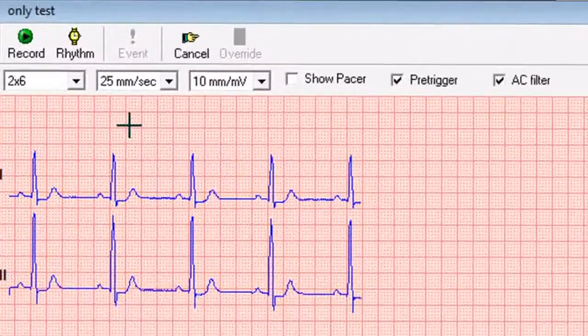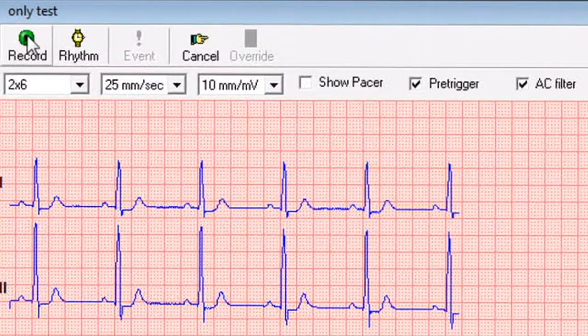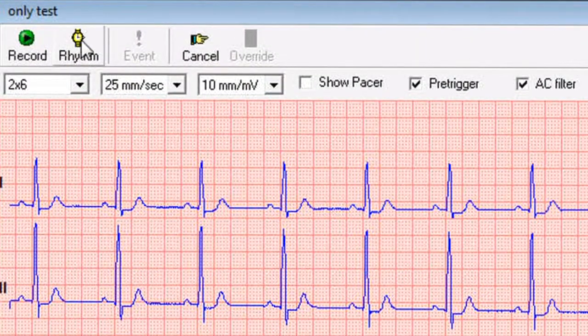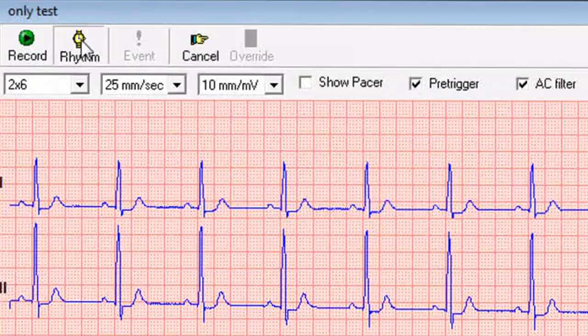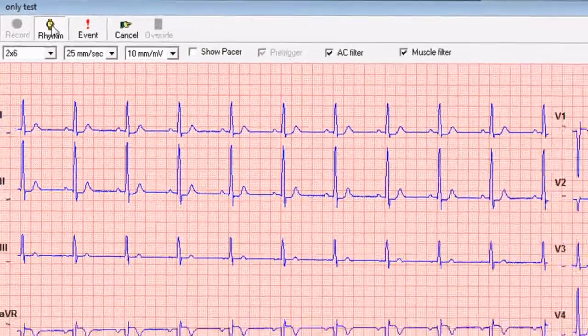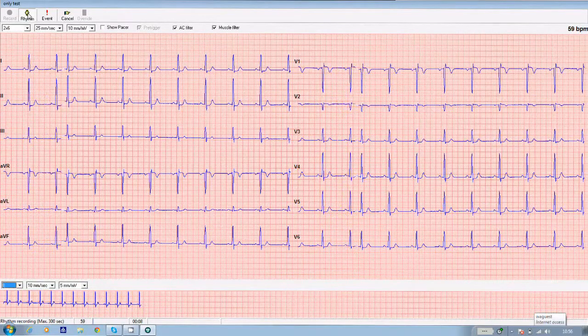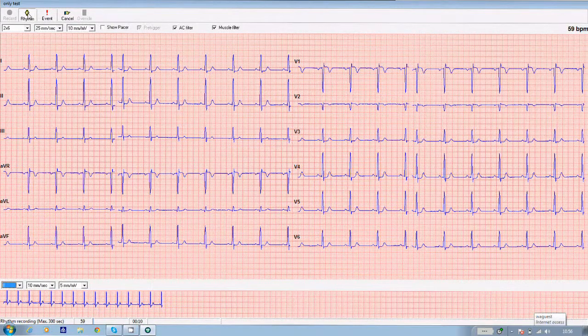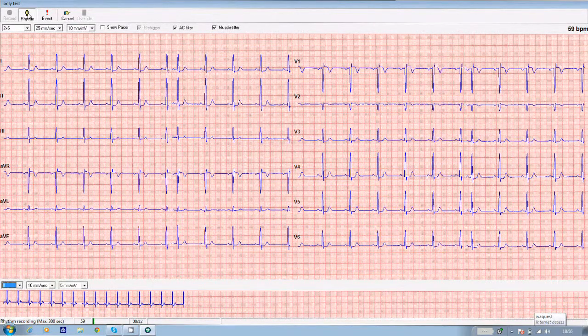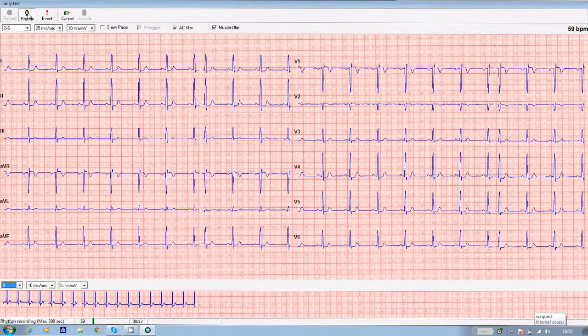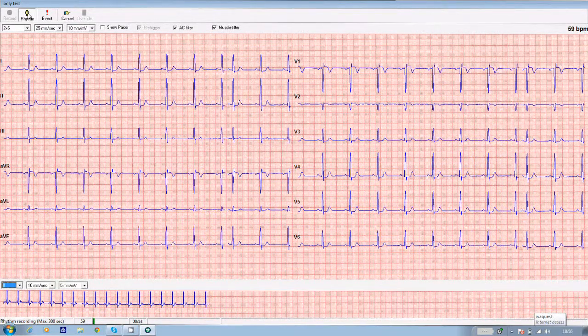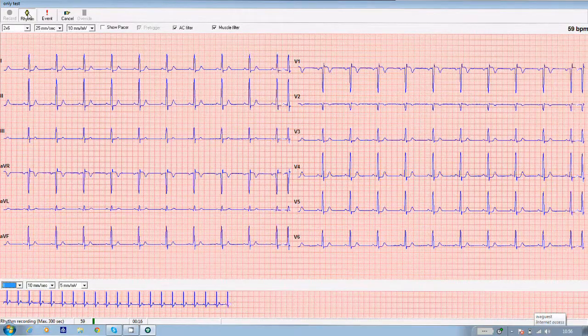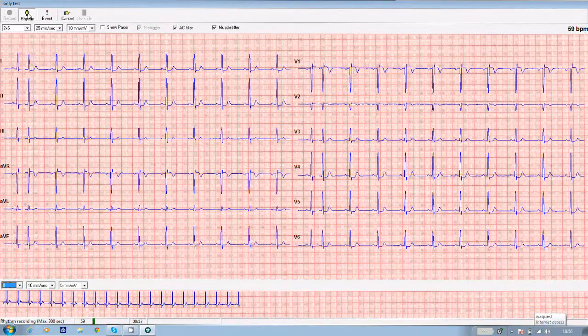But to take a rhythm ECG, instead of clicking on record in the top left hand corner, click on the rhythm icon next to it. Once you've clicked on that, the software will record five minutes of ECG if you want it to. But if you want to stop the recording before then, click on the rhythm tab again.